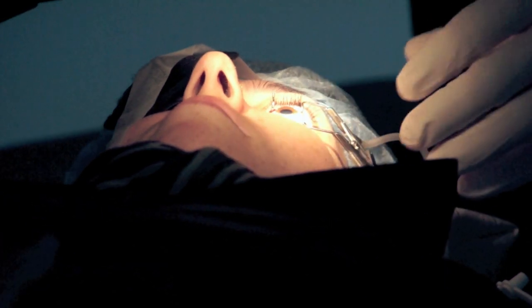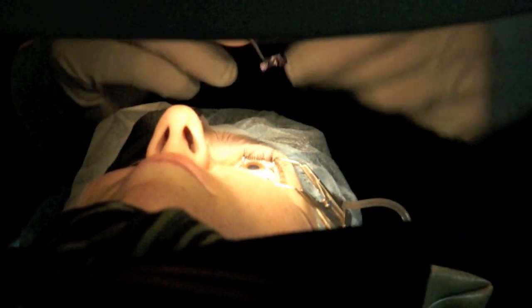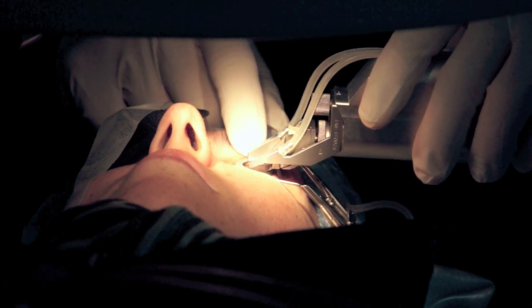Open your eyes wide. You're okay? No problem. Okay, you're going to notice a little pressure — that's how it holds. You're looking straight ahead.